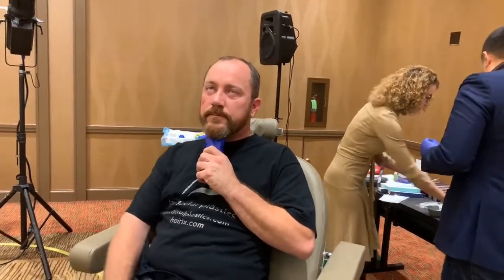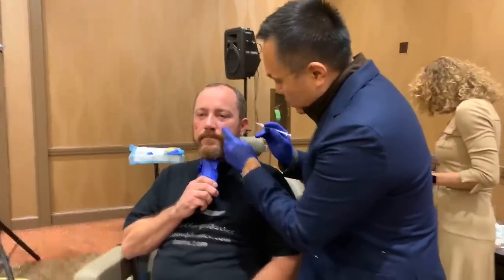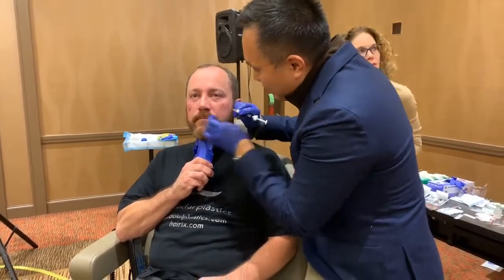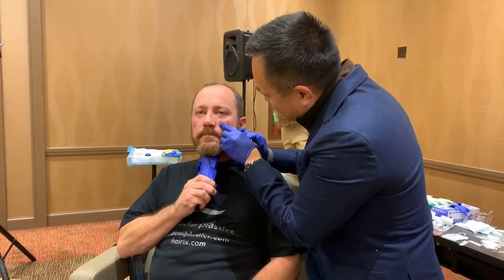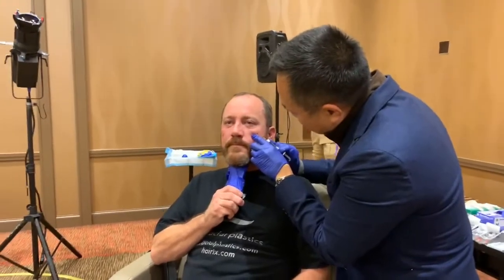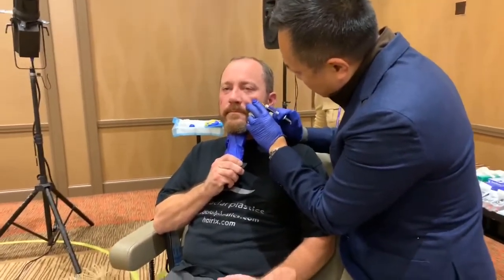I usually use a 22 or 21 gauge needle for entry — actually I'm liking this 18; I may just switch. I'm going in horizontal, about two-thirds back, and I can really control this. I'll switch to an 18 on the fly. A little wiggle attack — patients understand they may feel like they're in a slight California earthquake to the face.